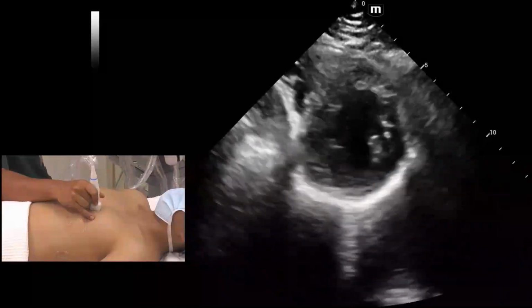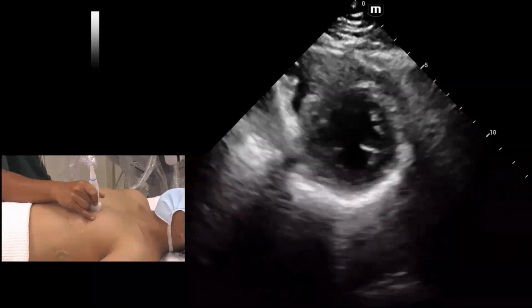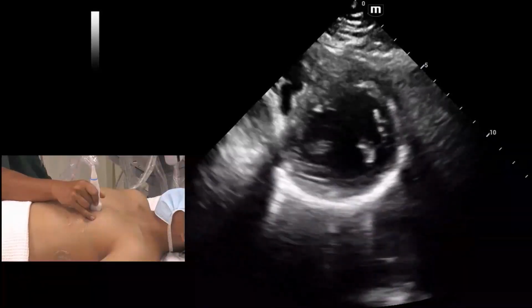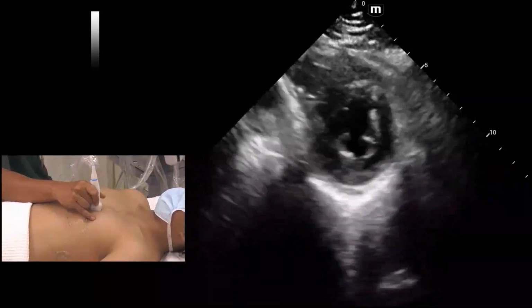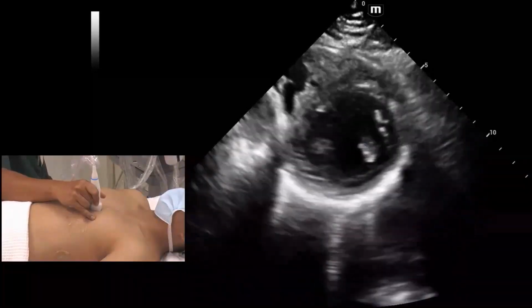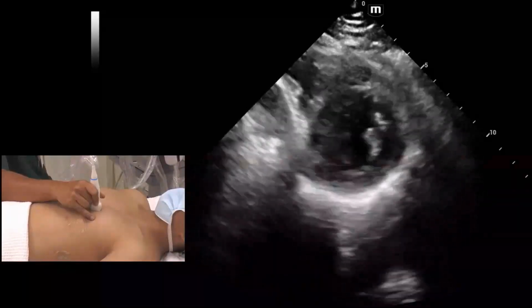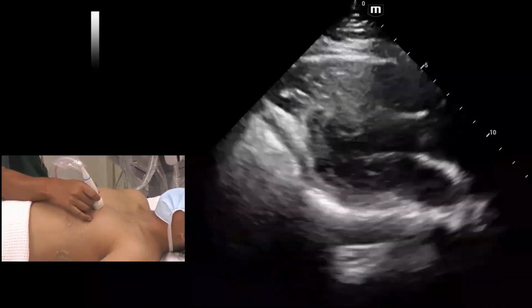It's not really important, because if the patient is hypotensive and in shock, regardless of the EF, what we want to know is whether it's depressed or normal, because the next management is either fluid, inotropes, or vasopressors, right? So this is to look at the systolic function.